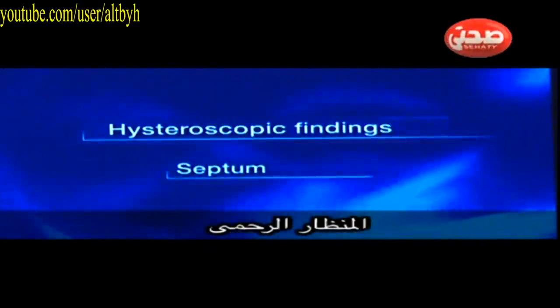Septum is another finding in patients trying to conceive with subfertility. If you suspect a septum, it's very important to undergo hysteroscopy with the plan to resect or remove the septum before IVF, because this can affect the treatment. This patient had 2 previous miscarriages and a septum was suspected on ultrasound scan. As you can see, the septum is very clearly seen, and it seems like 2 cavities, but it's a long septum.